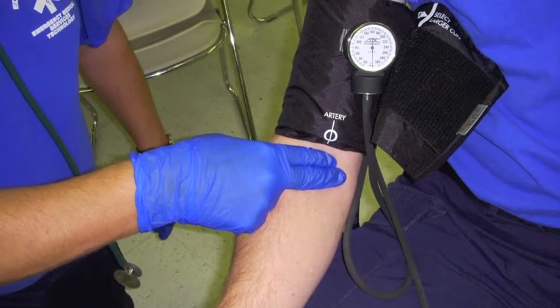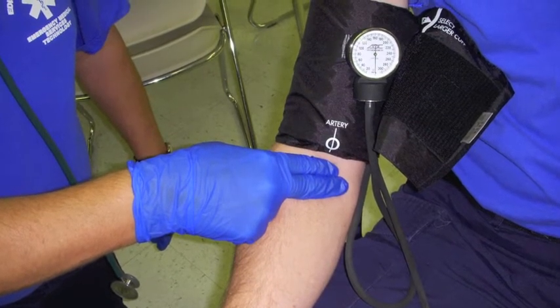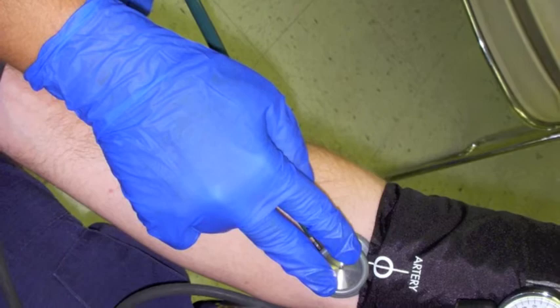Palpate the brachial artery under the blood pressure cuff on the medial aspect of the arm. Place the stethoscope over the brachial artery and close the valve on the ball pump.